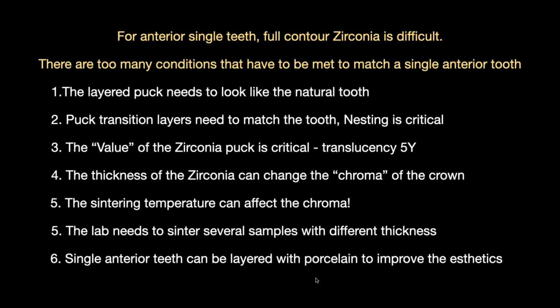So if the puck, a multi-layer puck, how do you know it's going to look like the natural tooth? So let's just say that your life depended on matching a single central with just full contour zirconia. That would be a tough one.